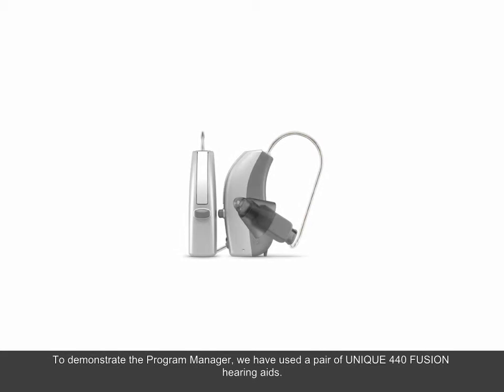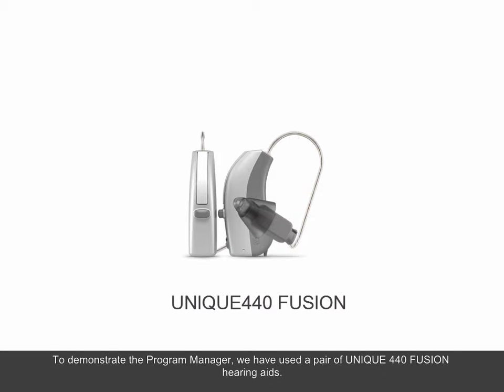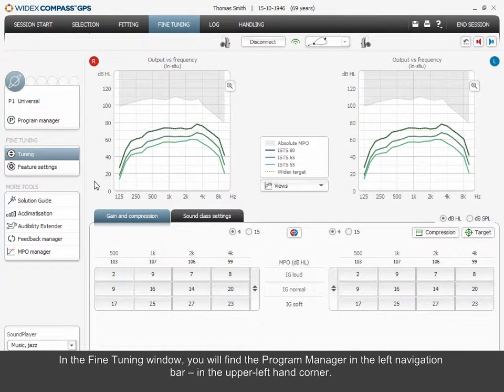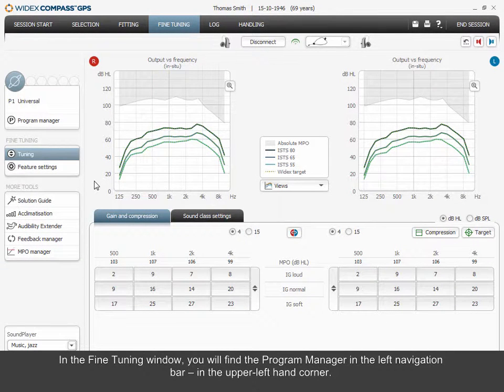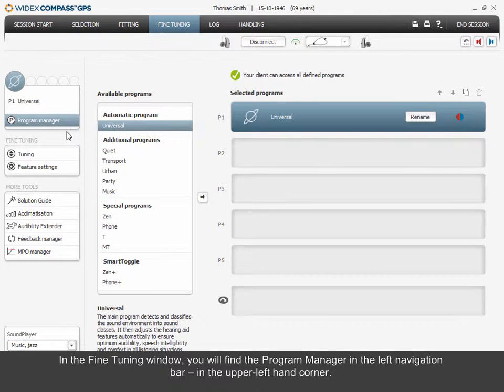To demonstrate the Program Manager, we have used a pair of unique 440 Fusion hearing aids. In the fine-tuning window, you will find the Program Manager in the left navigation bar, in the upper left-hand corner.